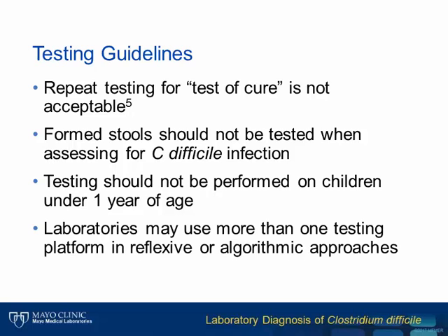In summary, there are a variety of testing methodologies available, and laboratories may use more than one testing platform in reflexive or algorithmic approaches when assessing C. difficile diagnosis.